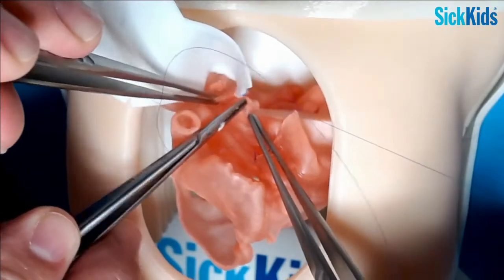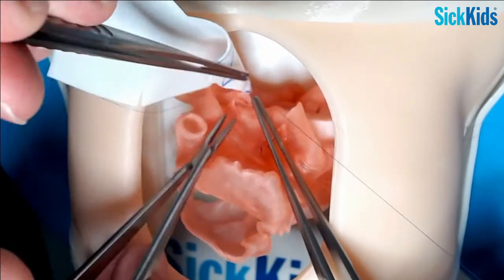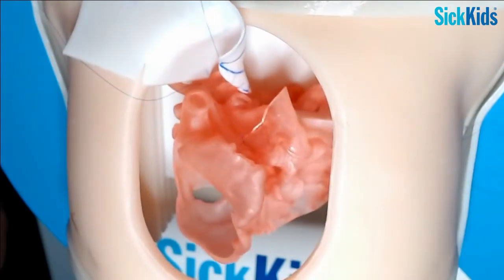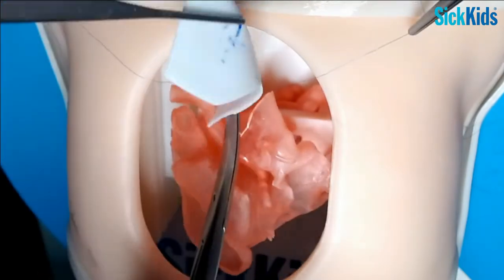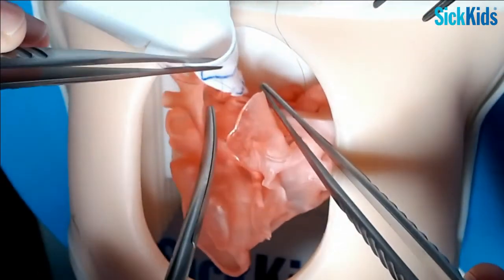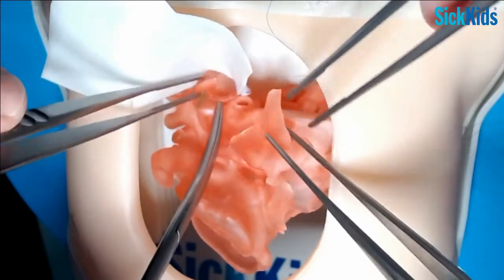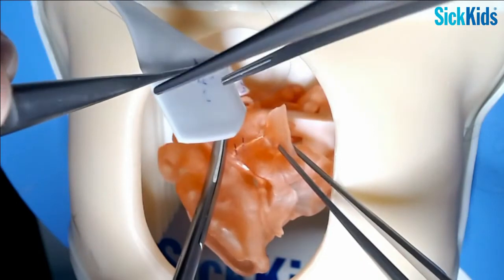And the next important place where you make another cut is up in the corner. So when you get to the corner where it changes from the arch to the ascending aorta, is a very important place to make a cut so it doesn't kink. So that's supposed to be to that, to that. Hold this like this.